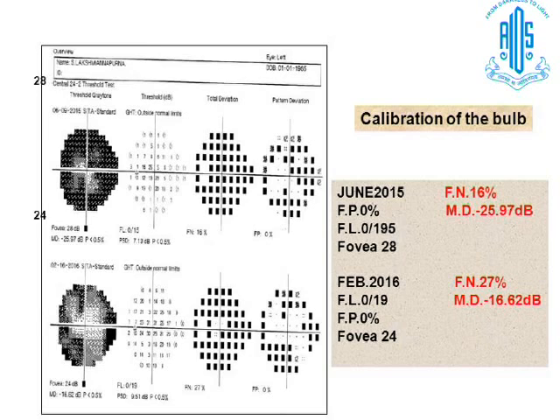Because if you see the raw data, usually we see a negative sign in front of 0. But here it appears as a negative sign in front of a digit, the sensitivity being 1. So whenever this is there, it requires cleaning of the machine, recalibration of the bulb, or changing the bulb.